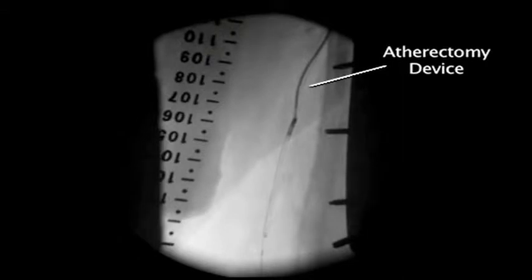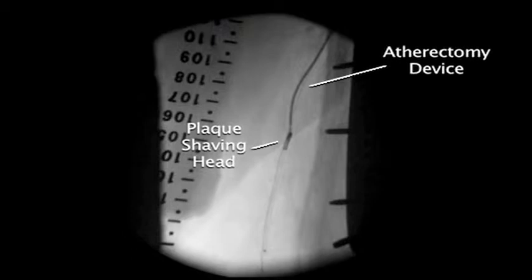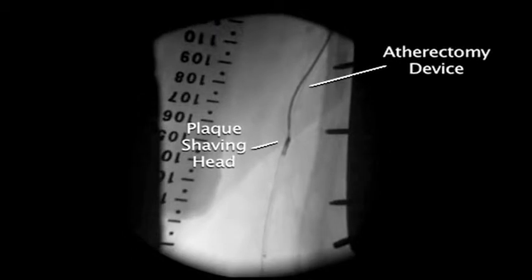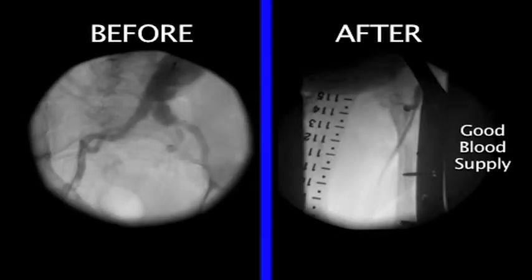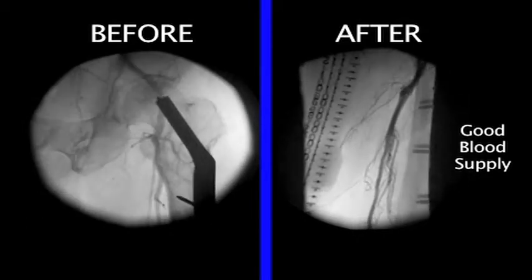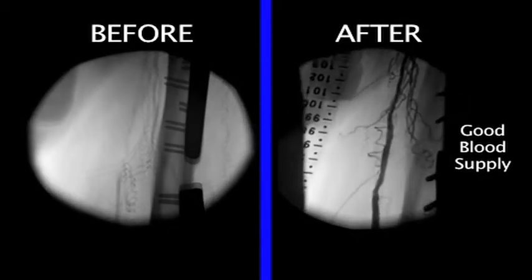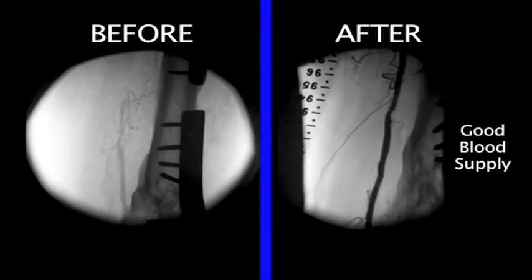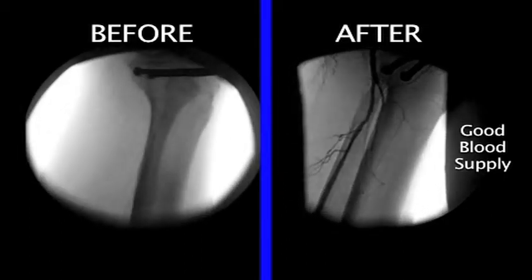Here's the angiogram now showing the device advanced over a wire. We always know where we are because we put the wire down like a railroad track and push a locomotive spinning device over the wire. You can see there's still a residual blockage in the pelvic area, but we have very good blood supply down the leg — that dense black area in the middle is the artery, which was not visualized before, all the way down to the toes.